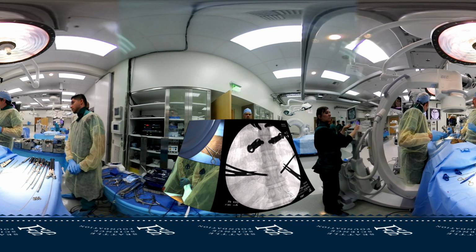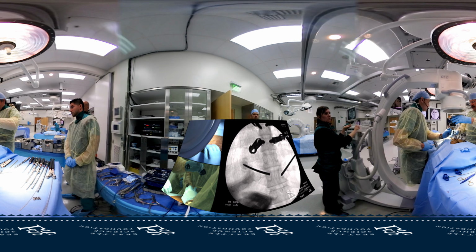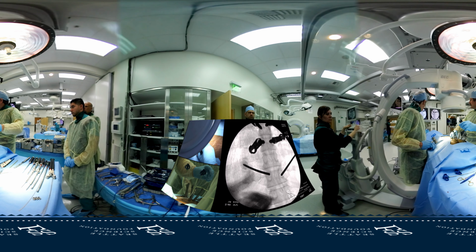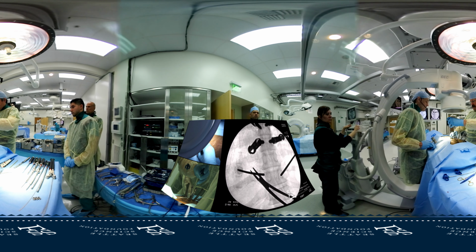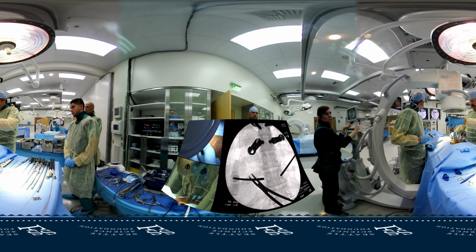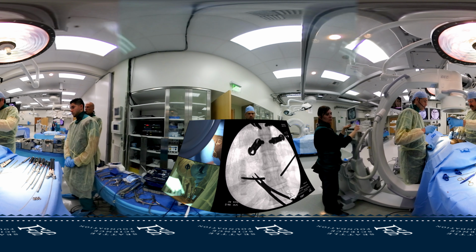Let's see that a second. Move that one a little lateral. We'll just move that one a little lateral. Let's see. Again, a lot of times as you're feeling a patient's anatomy, particularly in the thoracic spine, I can feel I'm up on top of the transverse process, and I'll drop in a little. Sometimes it's hard to keep it from sliding when that's the situation.